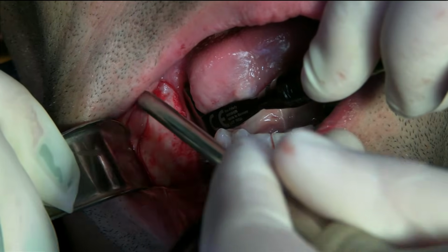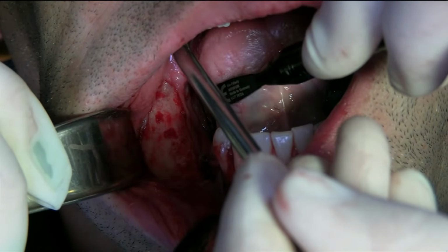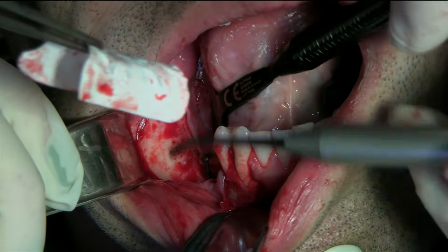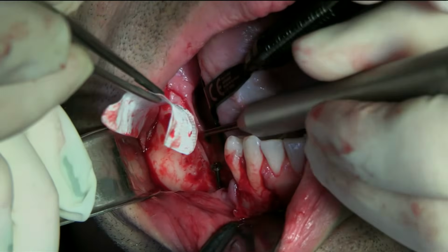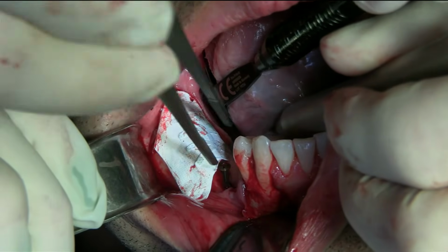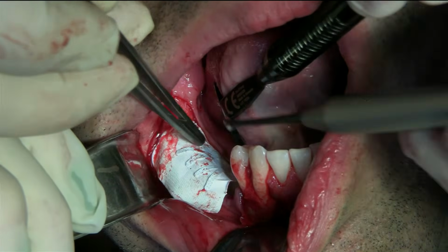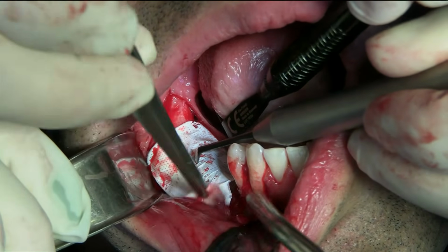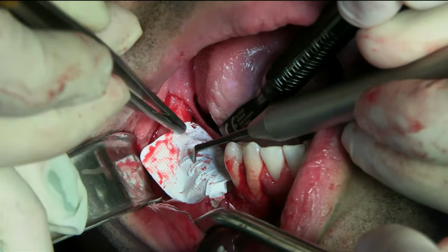Okay, so the tack did not go into the cortical bone. So usually what I do is I just try it one more time. Because the tack will be easier once it fits. Okay, this needs to go underneath here.